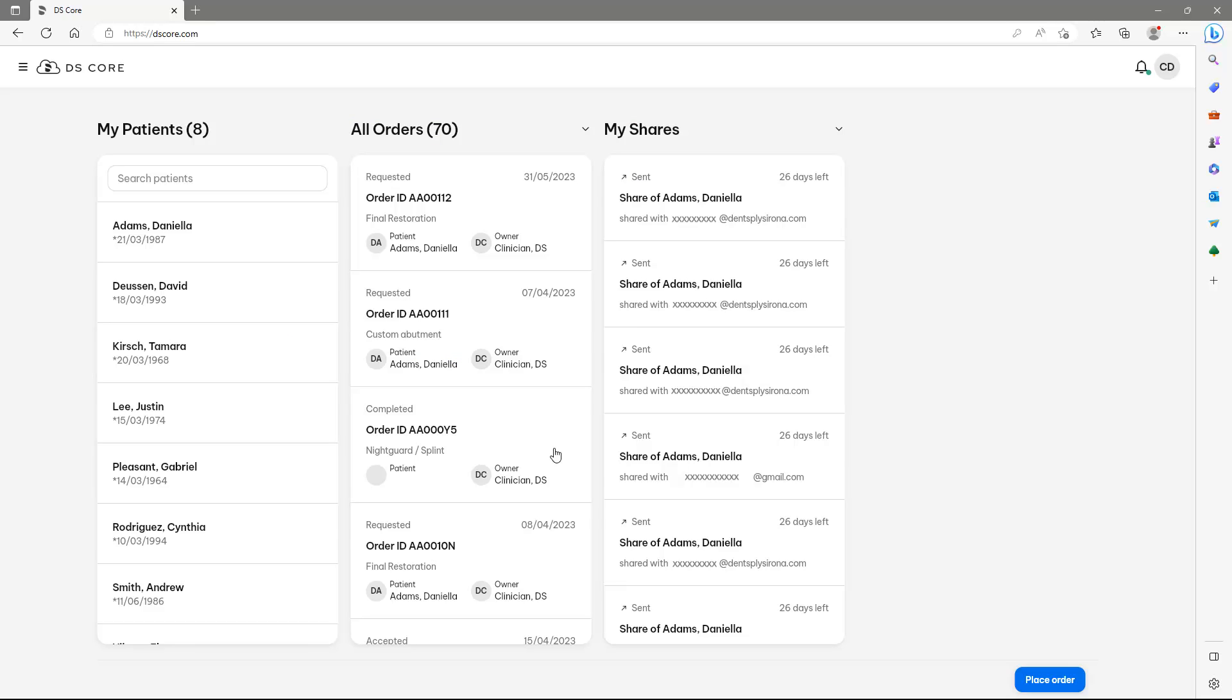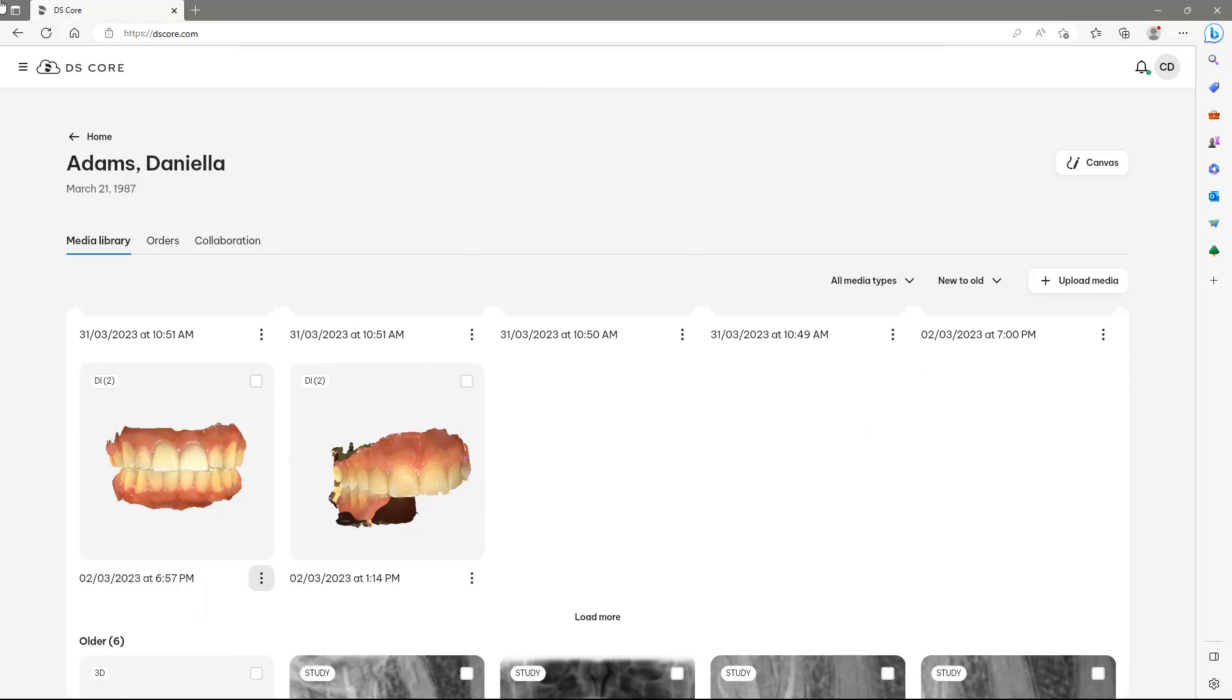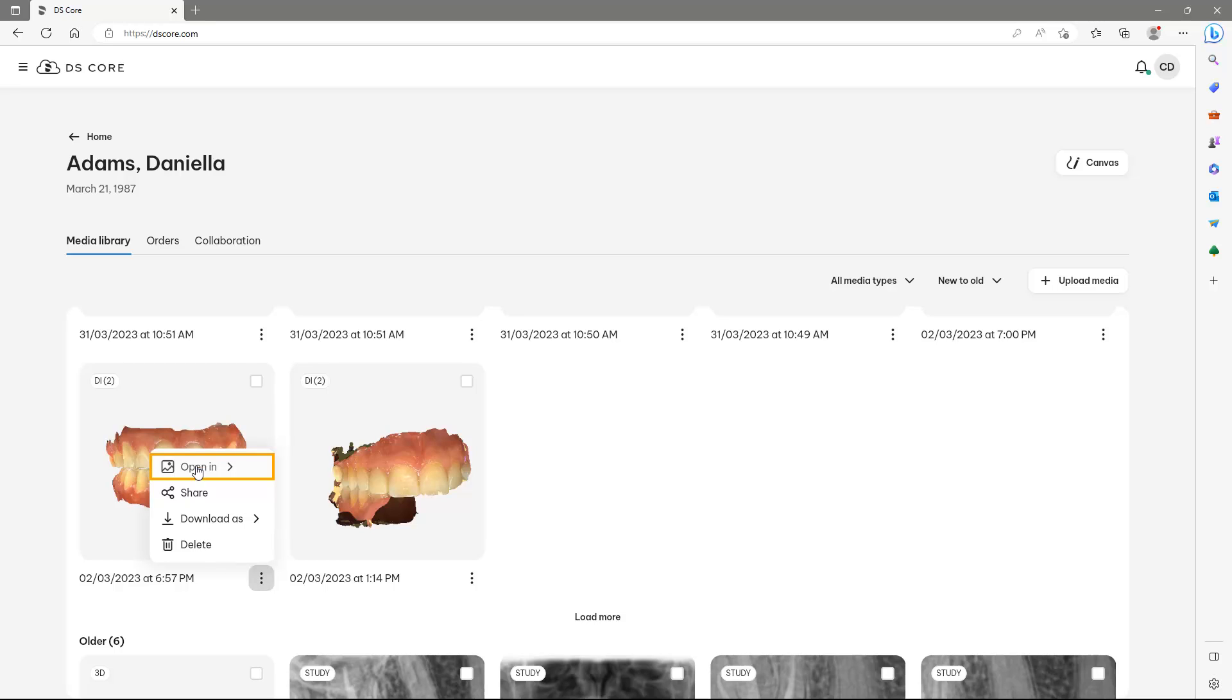For demonstration purposes, we tap on the first patient under My Patients. By scrolling down, we reach a DXD file. We tap on the three small dots at the bottom right, select the option Open In, and could now open the file in the InLab CAD software seamlessly.